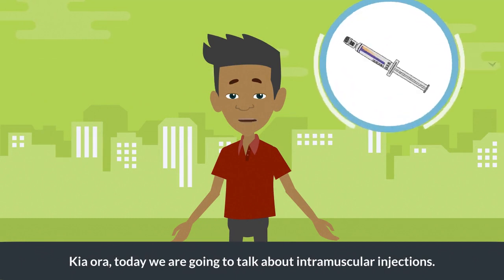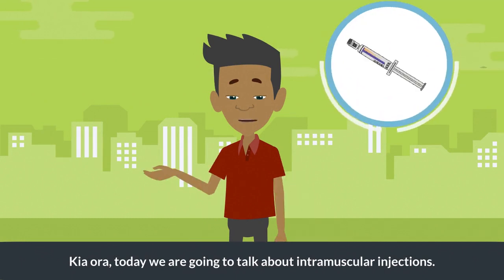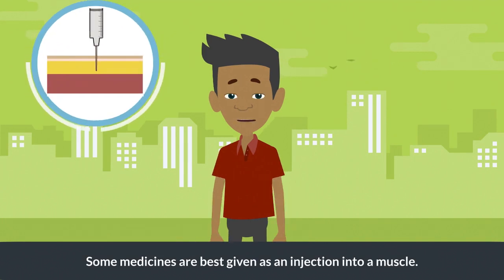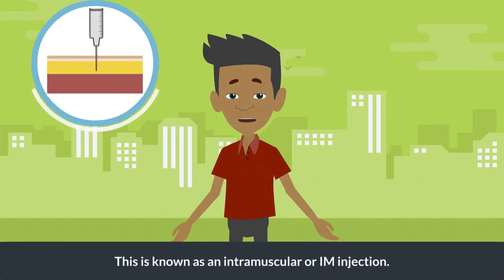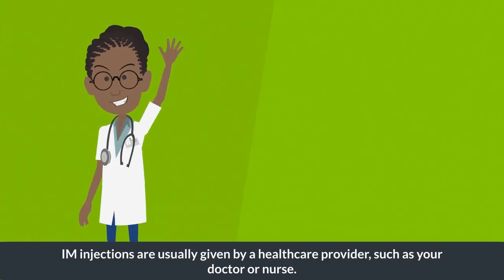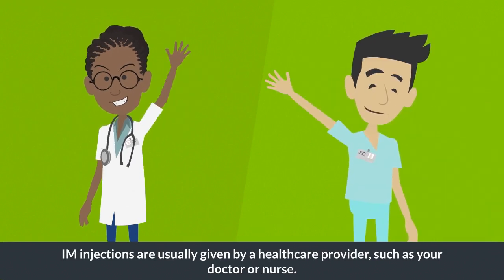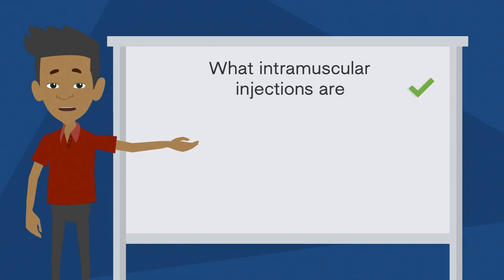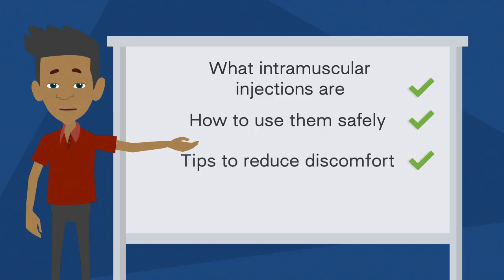Kia ora. Today we are going to talk about intramuscular injections. Some medicines are best given as an injection into a muscle — this is known as an intramuscular or IM injection. IM injections are usually given by a healthcare provider such as your doctor or nurse. However, if you need injections regularly, they may teach you or your caregiver how to do it. In this video you will learn what intramuscular injections are, how to use them safely, and tips to reduce any discomfort.